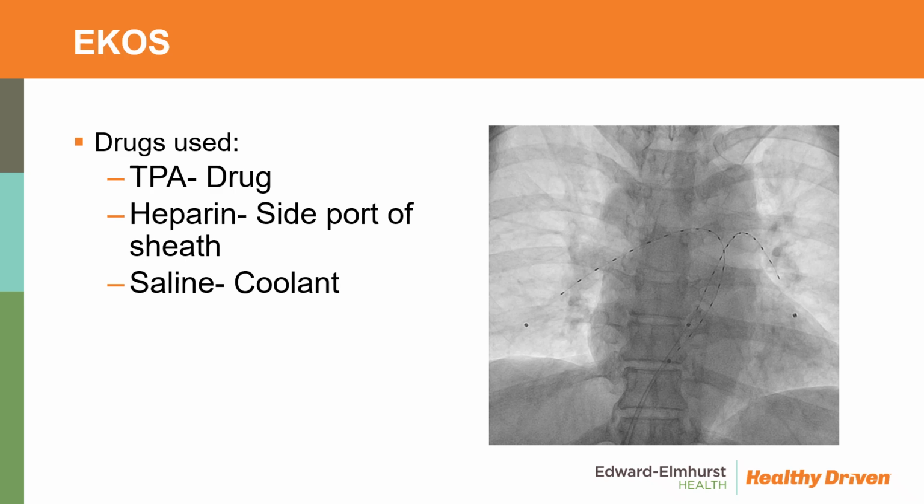The drug used is TPA. We run heparin to the side port of the sheath, and there's going to be another port that says coolant, and saline goes to that.